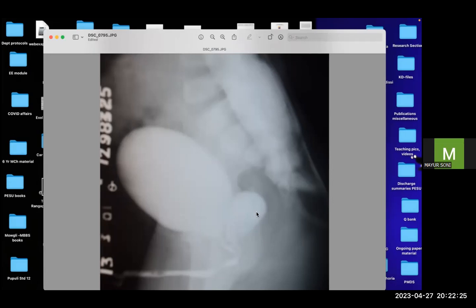The diverticulum seen is smooth walled and large in size. Ureters cannot be delineated in this study. What is the position of this diverticulum that you are describing? Retroprostatic, which means it's between the rectum and the urethra. And the bladder, you mean? In the bladder and the rectum. That's the bladder base there.